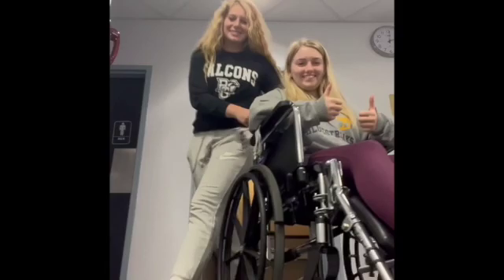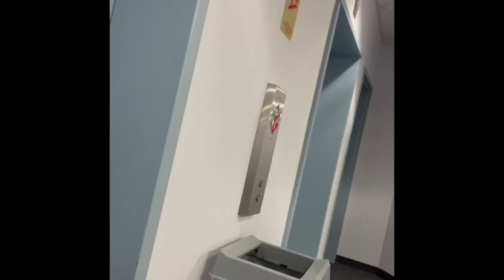If going forward into the elevator, push the button for the patient, go forward in, then push the floor number and turn the patient around inside — making sure not to hit their feet on the rails. Wait for the door to open.